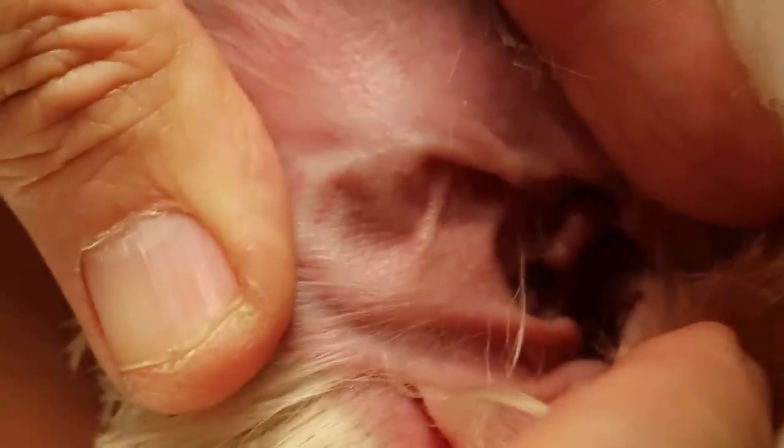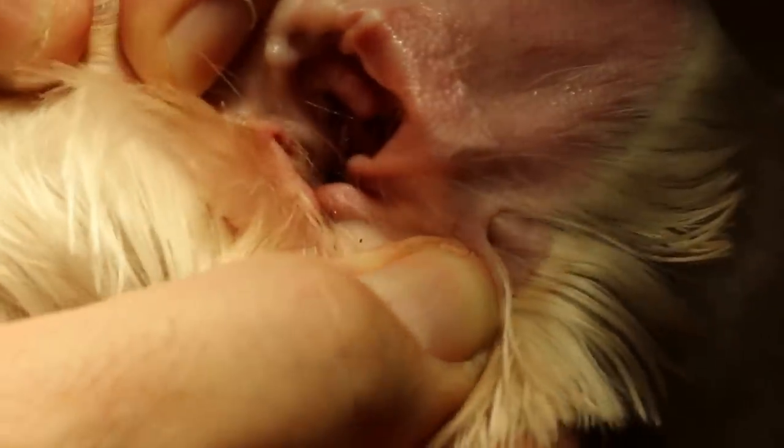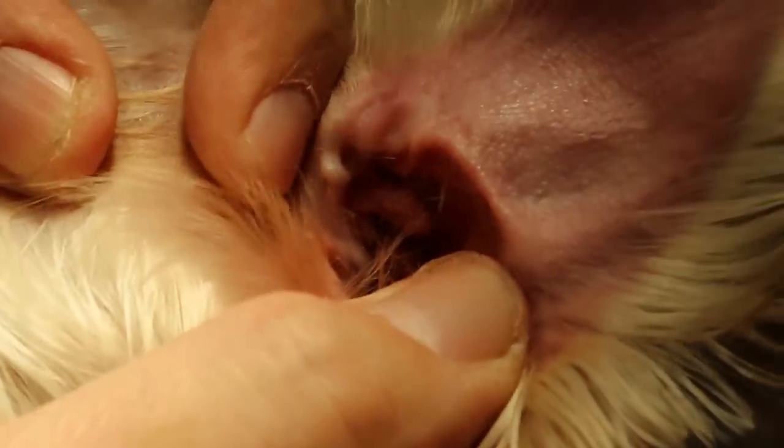The groomer told the owner the wax is very deep in, which is true. Normally this black wax is due to either mites or bleeding. This side has the same problem — you can see it's quite deep in. The groomer has tried her best to get as much out as possible, but she can't do much more than that.